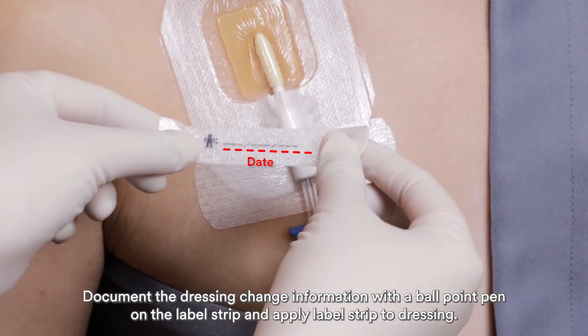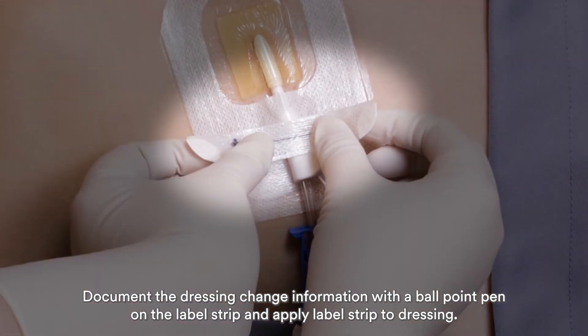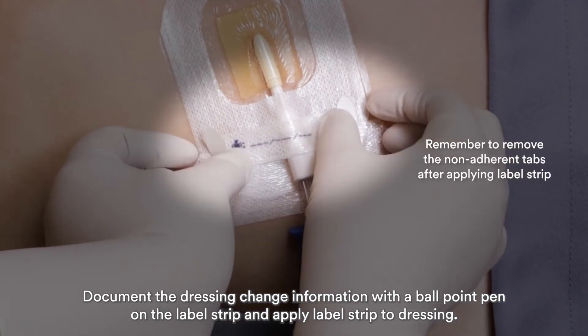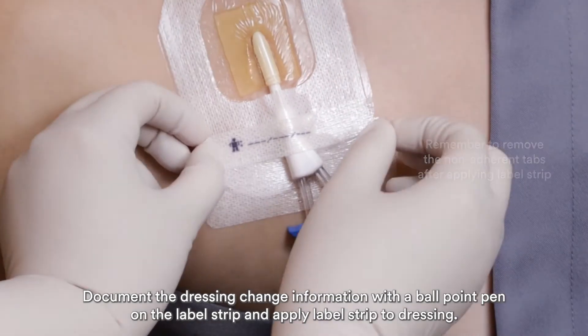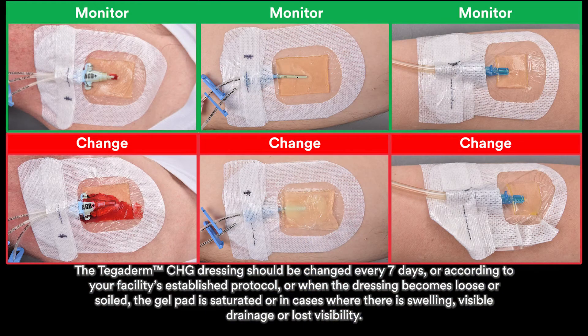Document the dressing change information with a ballpoint pen on the label strip and apply the label strip to the dressing. The Tegaderm CHG dressing should be changed every 7 days or according to your facility's established protocol, or when the dressing becomes loose or soiled, the gel pad is saturated, or in cases where there is swelling, visible drainage, or lost visibility.